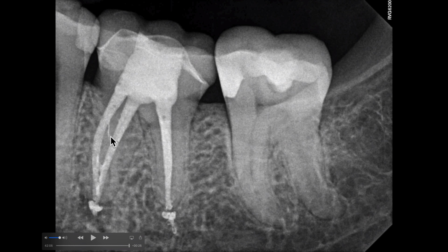And the only way fluid could get there is if you really removed any obstructions, which is why I was so picky with using the C-form and the alcohol and really trying to expose that. Because theoretically, if you just packed more schmutz in there in your retreatment technique, the GentleWave can't get in there either, because it's not going to remove that gutta percha. And so we remove it as a doctor. And so I love that, because my due diligence, I believe, was part of the reason why that was able to open up. And then I empowered the GentleWave, and that's fantastic, because look at that thing.